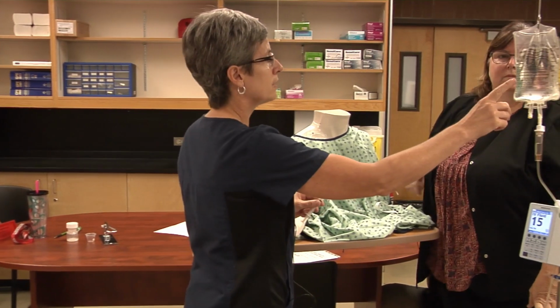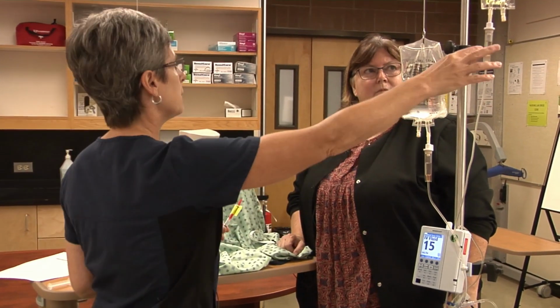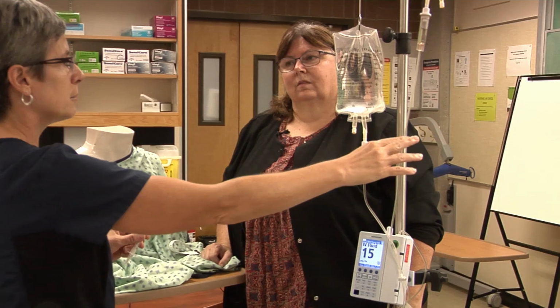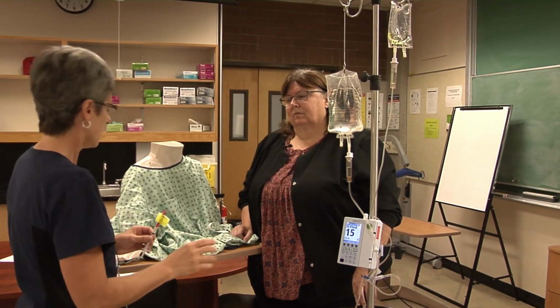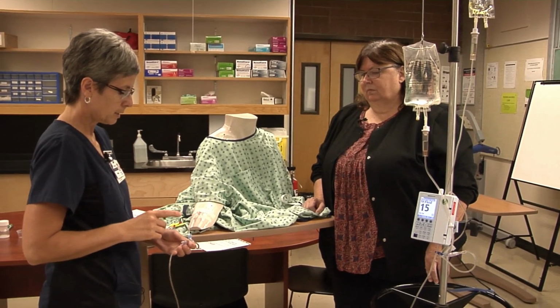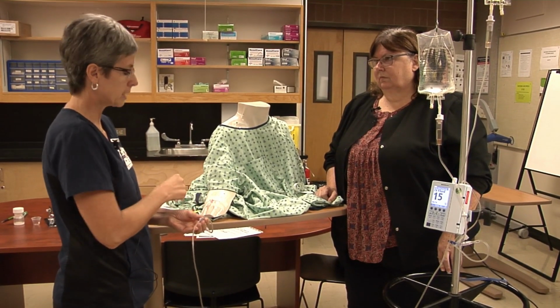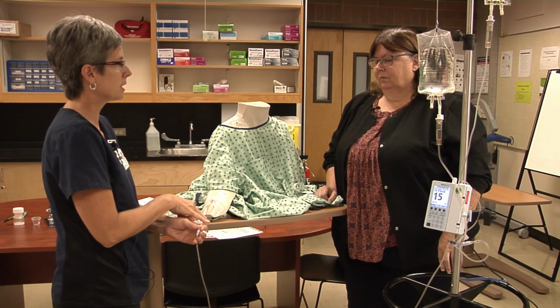So now I have an IV solution running. I also have a mini bag running as well, so I have to make sure that this drug is compatible with this solution and this solution. If everything's compatible, I can go ahead and push. If things aren't compatible, then I have to stop something. And what I have to think about is where's the port that I'm going to inject it in, and I can have nothing coming behind it that's going to potentially contaminate.